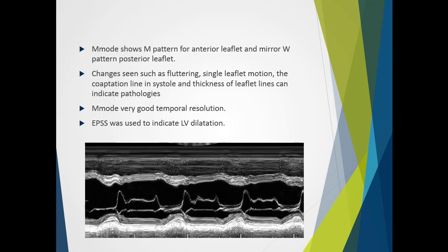EPSS, or E-point septal separation, was used to indicate LV dilatation. Basically, the greater the distance of the maximum excursion in early diastole — the E-point — and the basal septum S, the greater the cavity size and the probability of systolic dysfunction. With M-mode, we have early diastolic filling, the period of diastasis, the atrial contraction mirrored by the posterior leaflet, and the point of coaptation in systole.